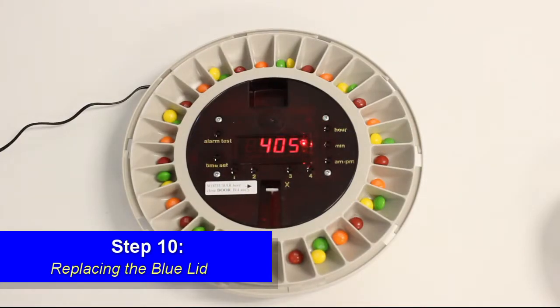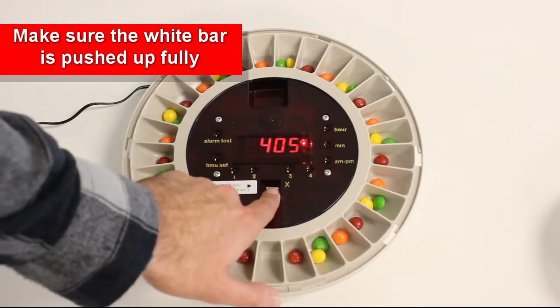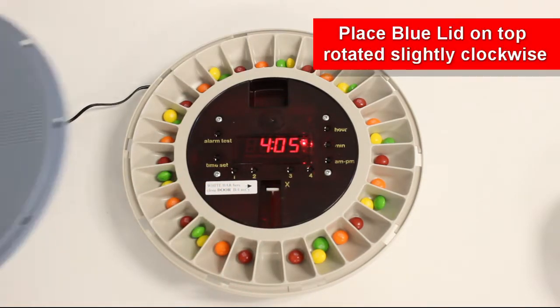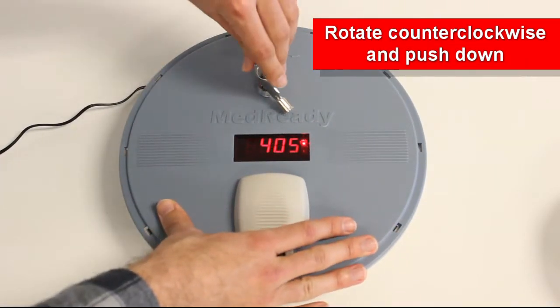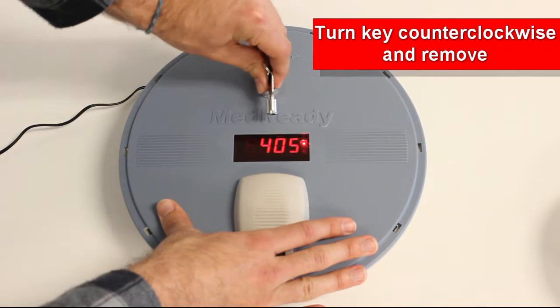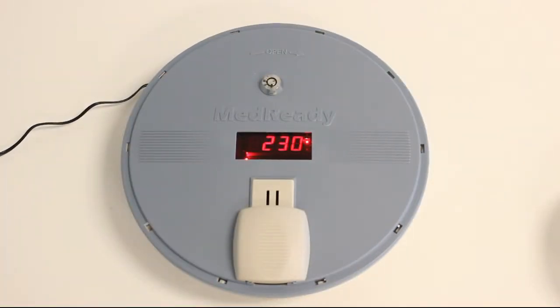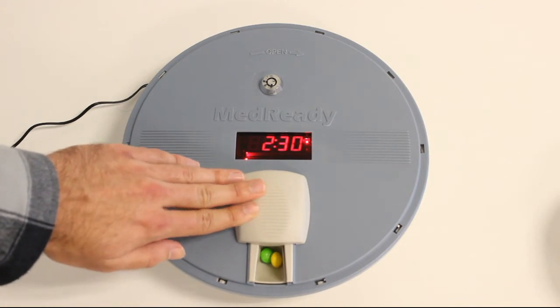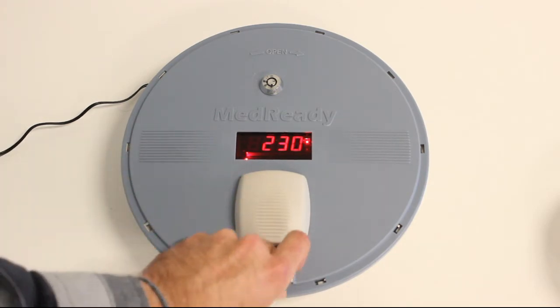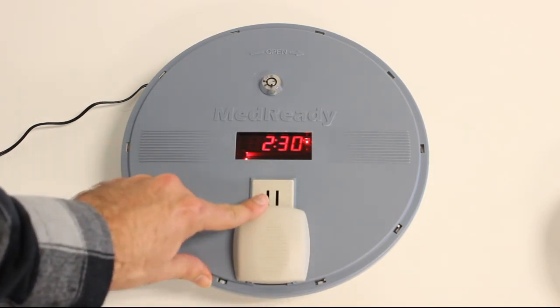Step 10: Replacing the blue lid. Make sure the white bar is pushed up fully. Place the blue lid on top of the device rotated slightly clockwise. Once in place, rotate the lid counterclockwise and push down. Rotate the key counterclockwise and remove. When your alarm goes off, slide open the gray cap to stop the alarm, then take your medication. Don't forget to close the lid when you are done.